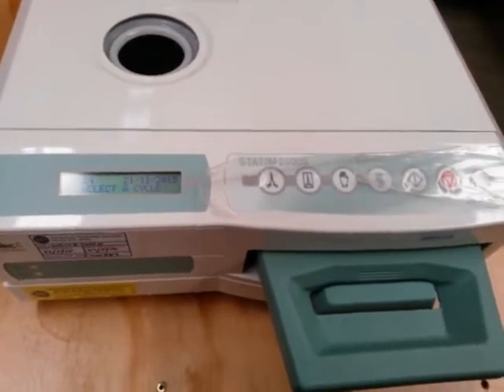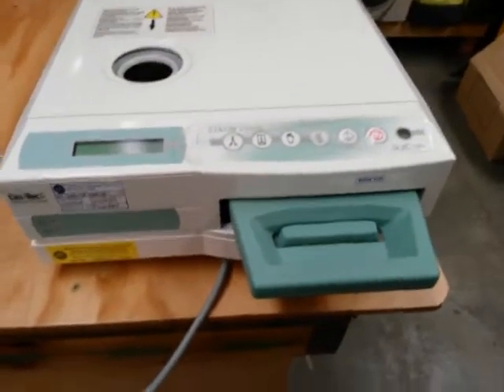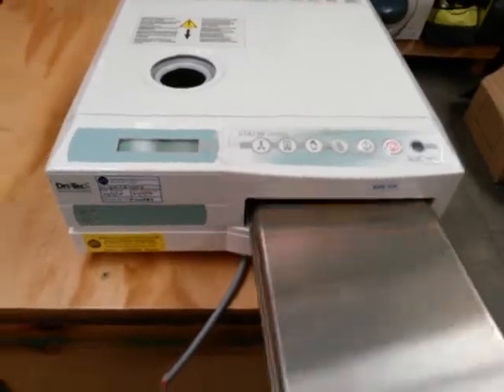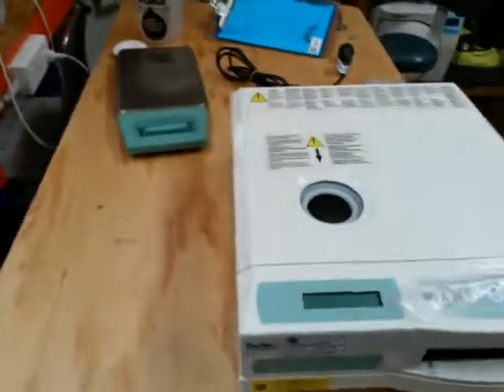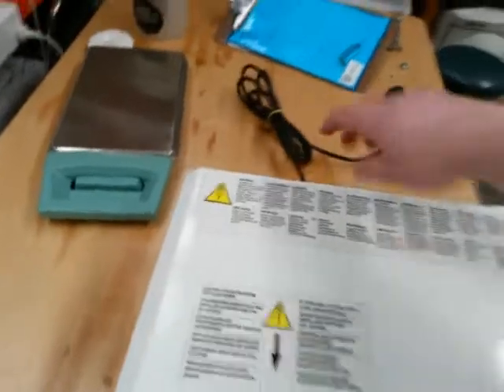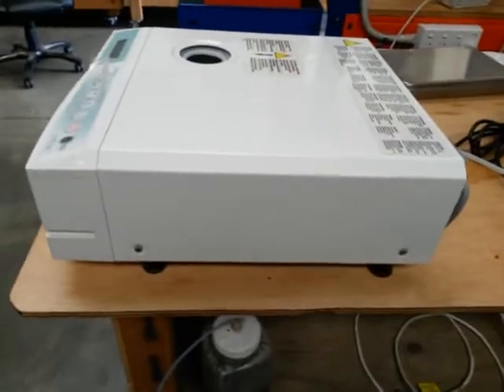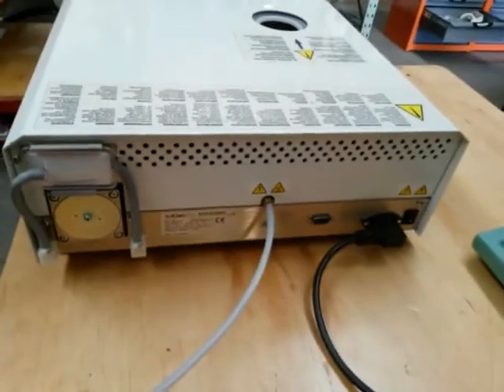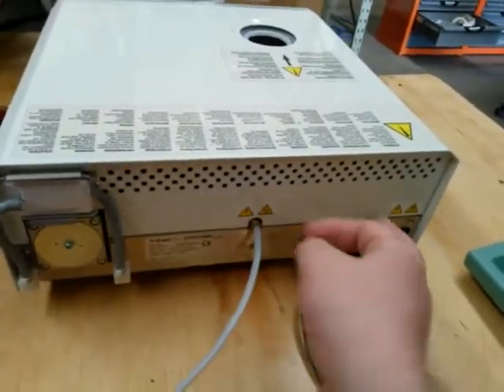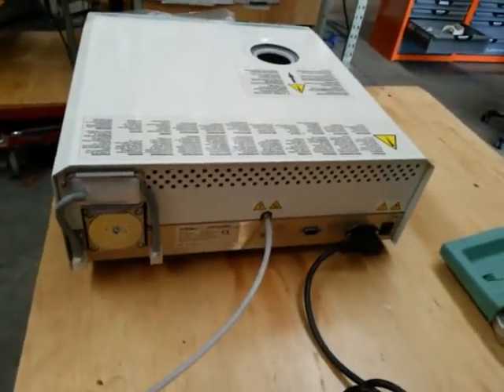So the next step is to have a look at the solenoid valve itself. To get the covers off, first we need to remove the cassette from the unit, put that aside, and unplug the unit — make sure the power is switched off. On the side we've got two screws on either side with a Phillips head screwdriver, and three screws on the back. Don't take the one that holds the solenoid bracket.